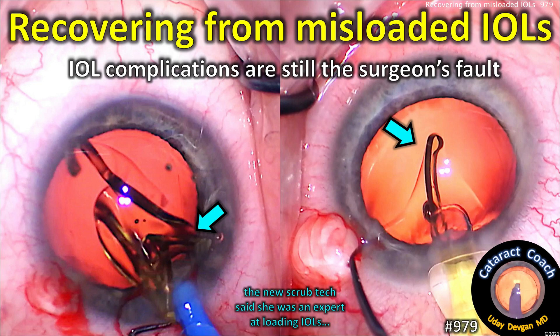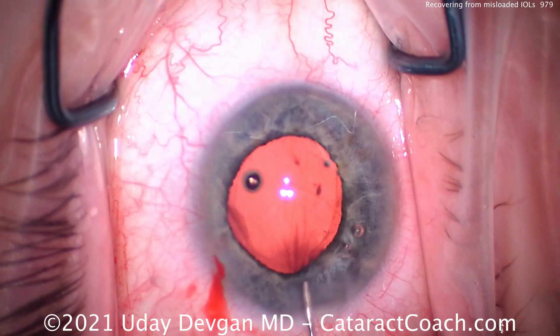CataractCoach.com — recovering from misloaded IOLs. Remember, IOL complications are still the surgeon's fault.